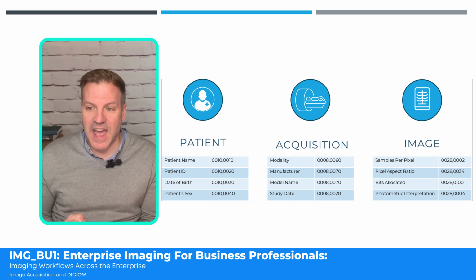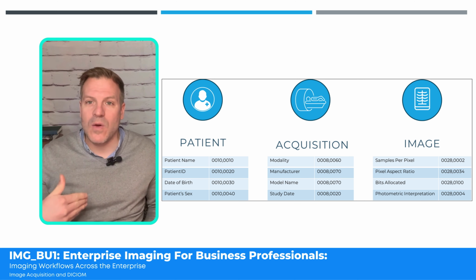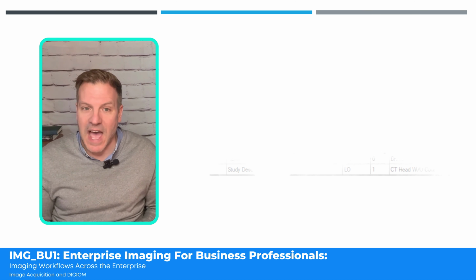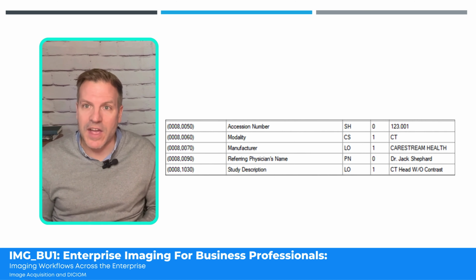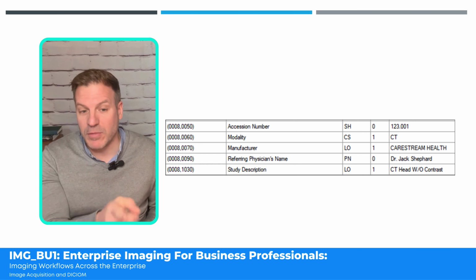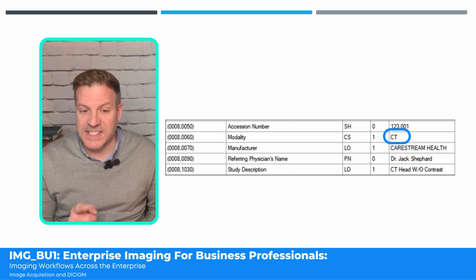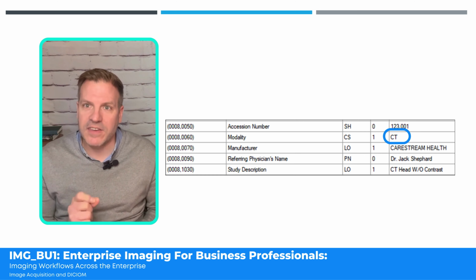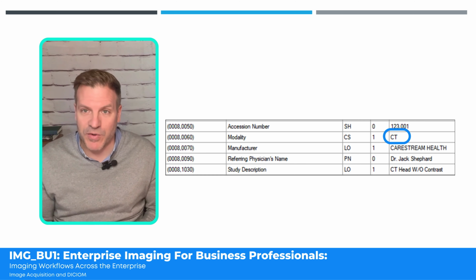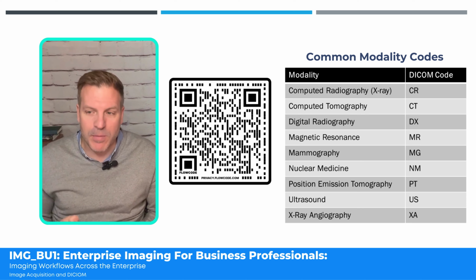We talked a bit before about the way that we identify modalities: there is a specific DICOM standard for every single modality code. So if I'm looking at this DICOM tag, I can see that the modality is CT, and that is the defined DICOM tag for computed tomography. And if I wanted to explore this further, I can go on the DICOM website and see a full comprehensive list of all of their modalities.